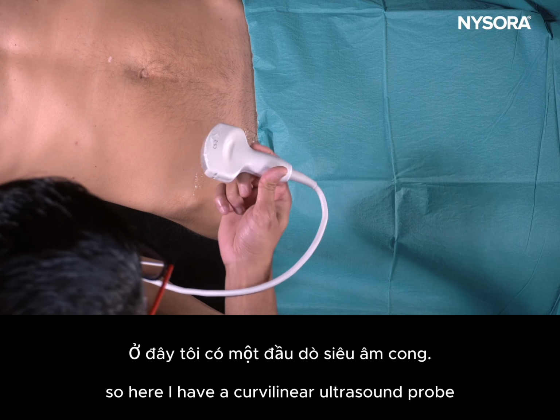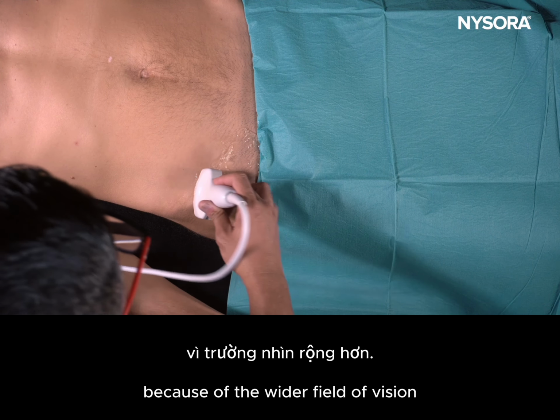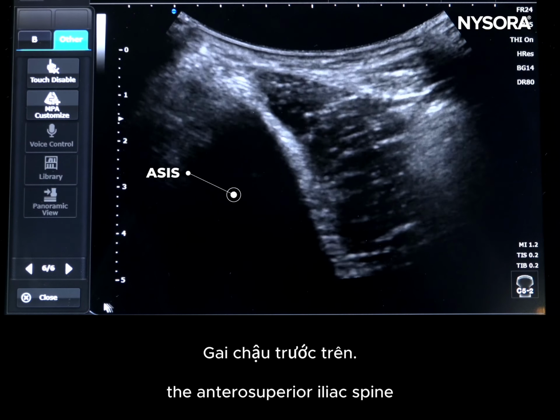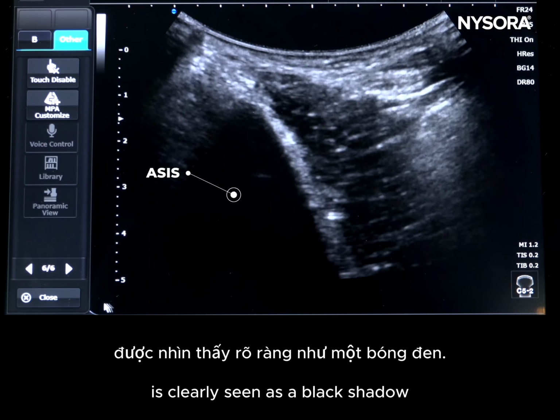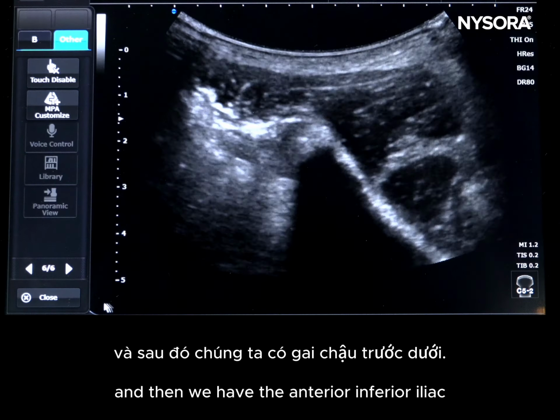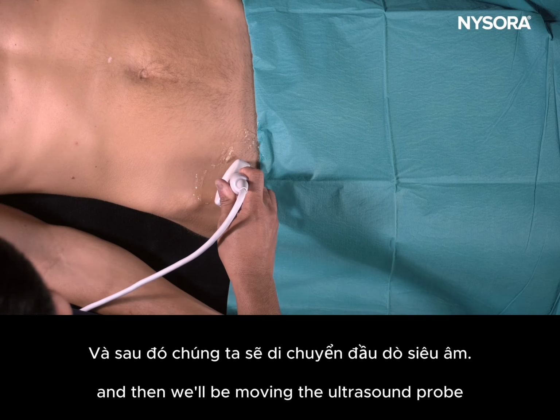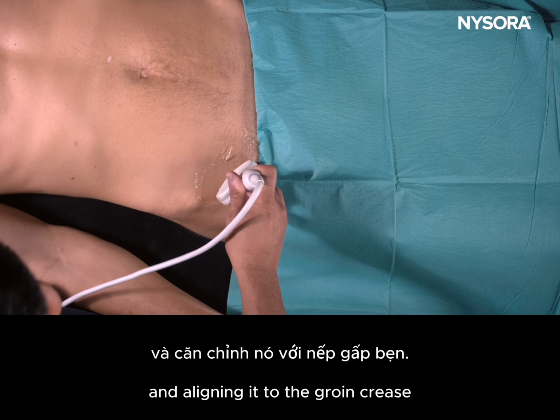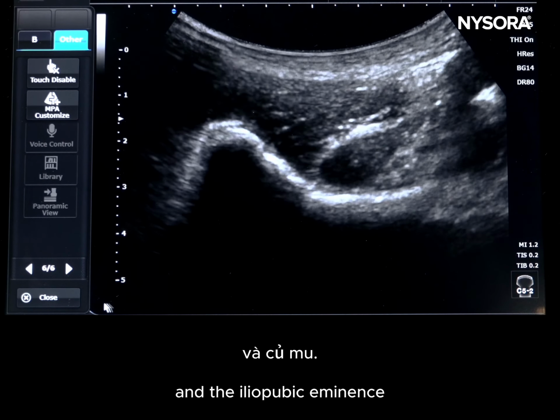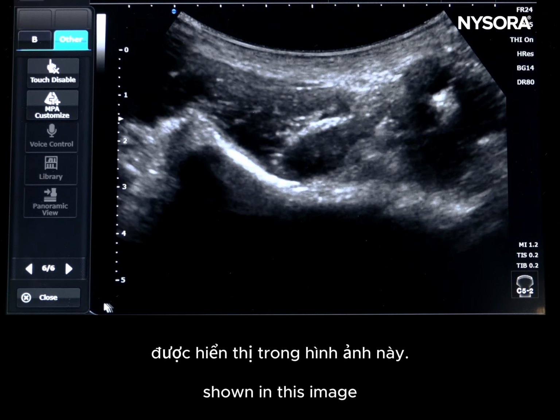So here I have a curvilinear ultrasound probe. I would recommend using a curvilinear ultrasound probe because of the wider field of vision. We're starting at the anterior superior iliac spine. As you can see on the ultrasound, the anterior superior iliac spine is clearly seen as a black shadow. Now we're moving the probe caudad, and the anterior inferior iliac spine comes into view. Then we'll move the probe and align it to the groin crease, looking for the iliopsoas tendon and the iliopubic eminence, and we have all the structures of interest shown in this image.